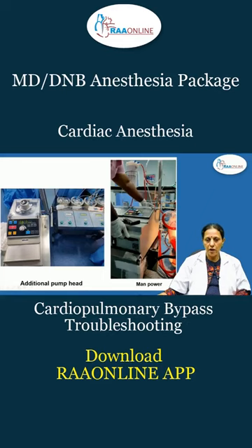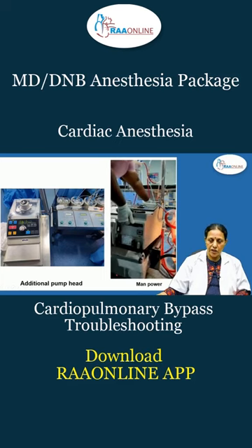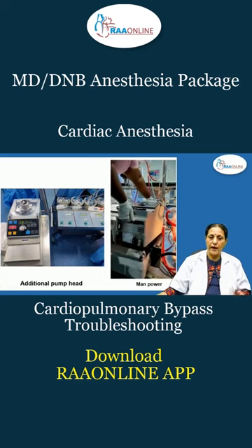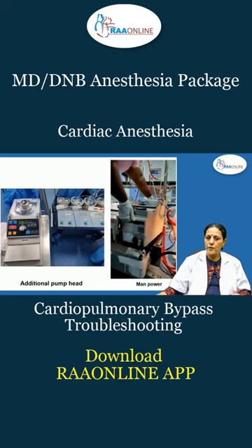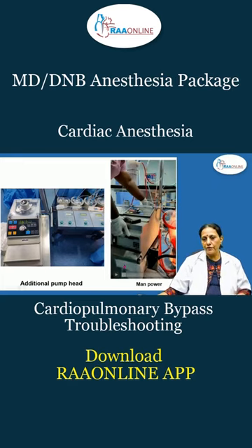This is the five-module heart-lung machine. There is an additional pump by the side — in this case, one of the pumps was not working. You can always have an additional pump so that if the main pump does not work, you can take the tubes and put them inside this pump and keep running.